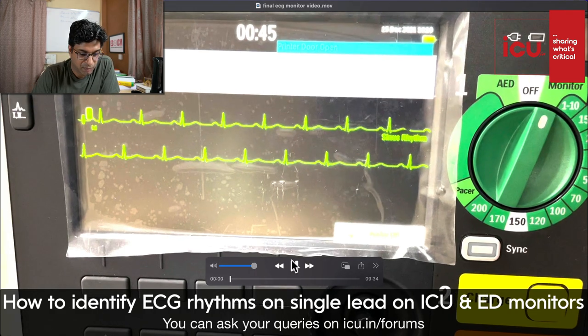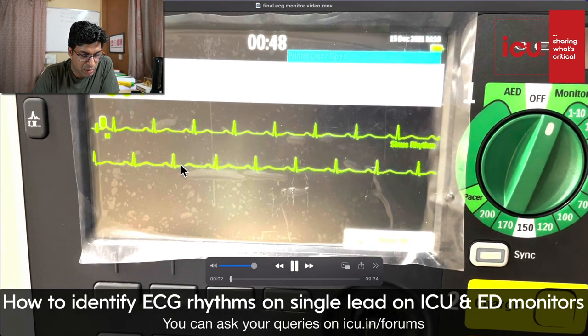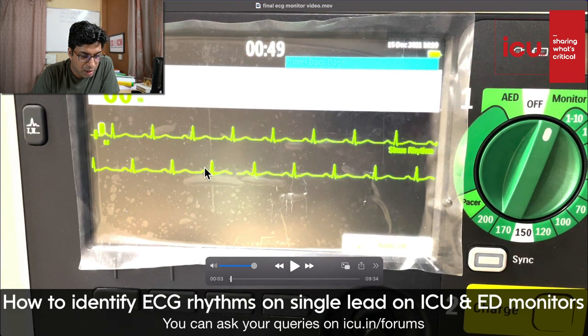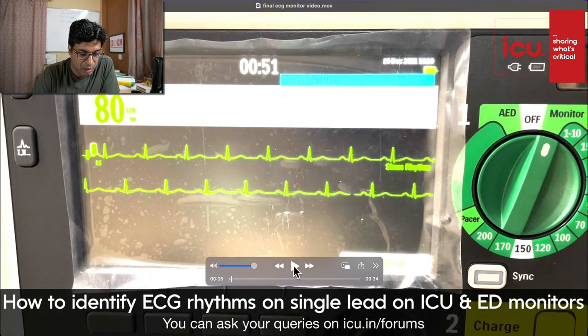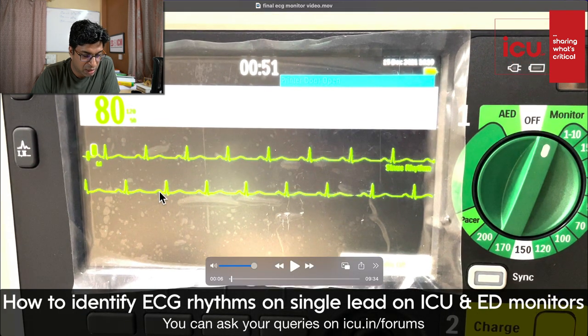Let's start. Now what you can see here, I'll stop. There is a P wave, followed by a PR interval. There is a narrow QRS complex, and it is pretty regular. So this rhythm is originating in the SA node. It's a normal rhythm. QRS complex is narrow.